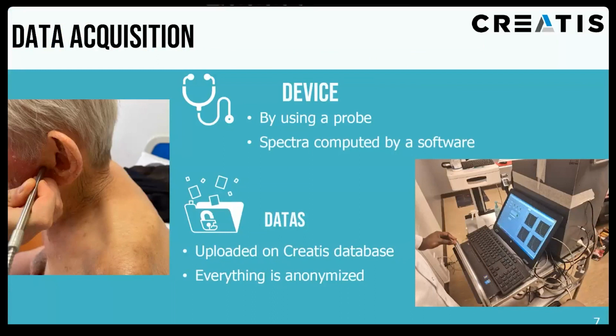So basically, this is how it works. The patient arrives at the hospital, let's say in the morning, and we do a first acquisition by using a probe which is connected to a PC, where we have software that is used to do all the calculations. After that, we apply a cream on the wound, and we let the patient rest for, let's say, a few hours. After that, we illuminate the wound, and we regularly come back to do new acquisitions. After that, everything is uploaded to a database.